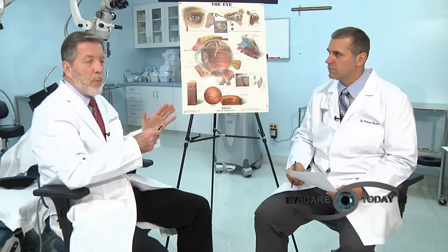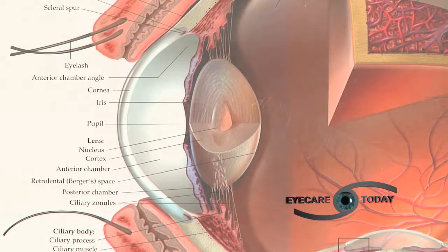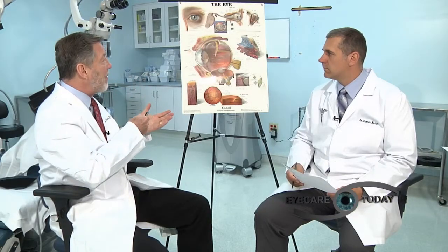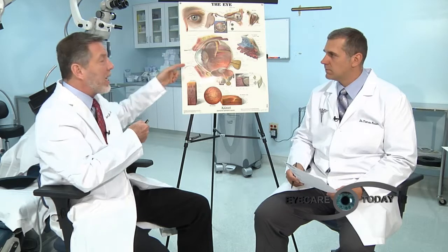Now, you can get the insurance generic lens, which about 40% of my patients do, but about 60% upgrade to what we call premium lenses that do above and beyond. One example, patients that have had astigmatism in their glasses, now the astigmatism correction can be in the implant itself, and thus it's inside the eye. So when the patient heals up the day after surgery, now they don't need that correction in front of their eye.